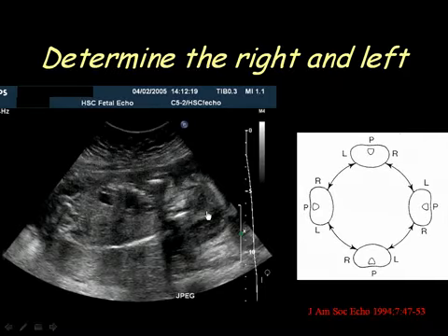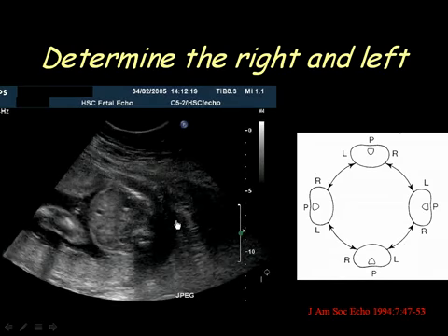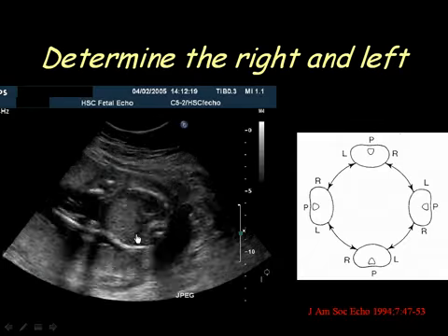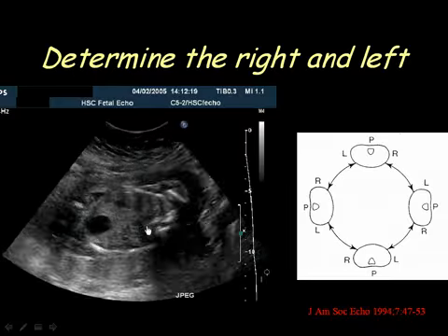Here the fetus is in longitudinal position with the head towards the left of the screen in front of you, and it doesn't matter where the sign here is, and it doesn't matter also where the marker of the probe is. This is the beauty of this article. And then here we are rotating 90 degrees, and then we look at the images.